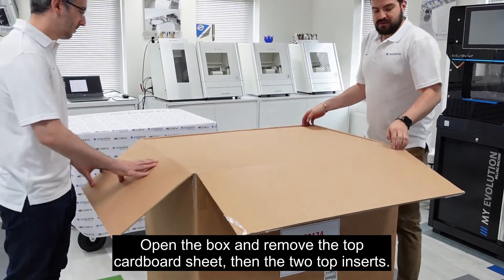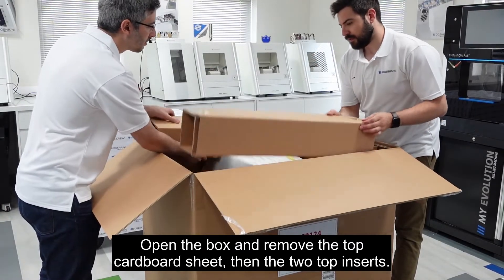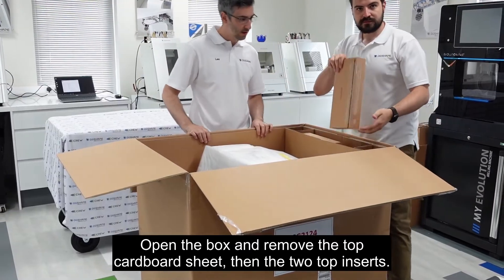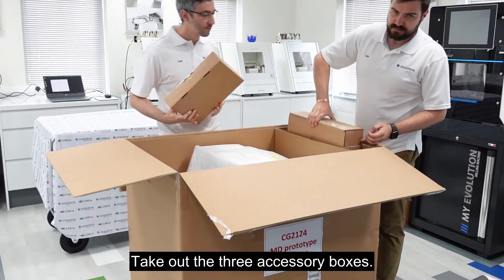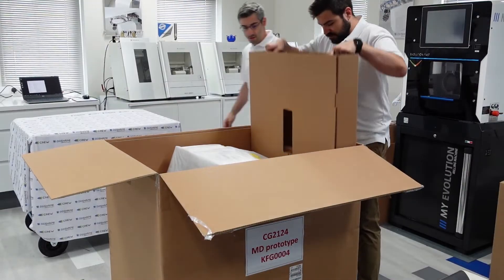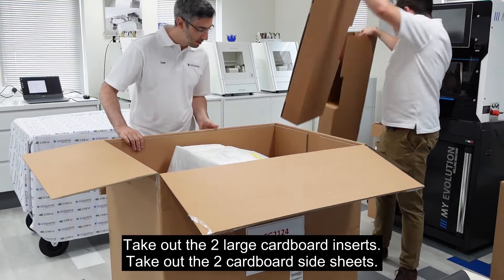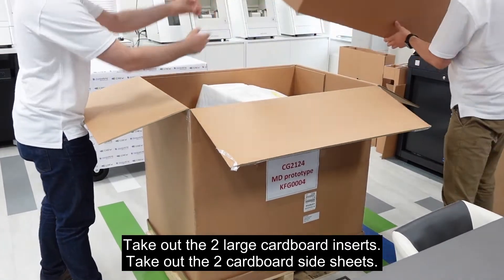Open the box and remove the top cardboard sheet, then the two top inserts. Take out the three accessory boxes. Take out the two large cardboard inserts, then the two cardboard side sheets.